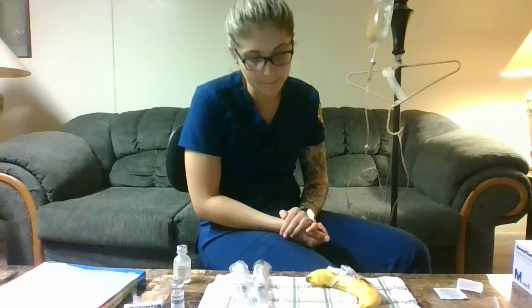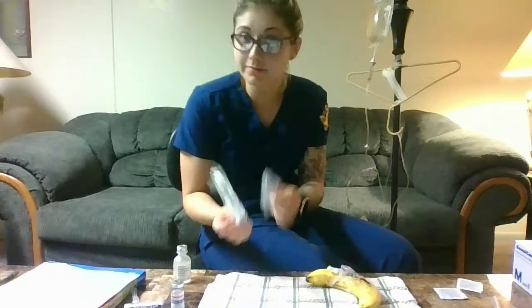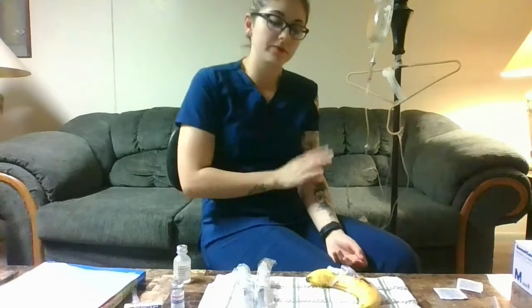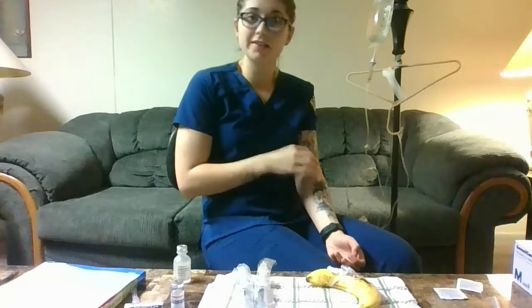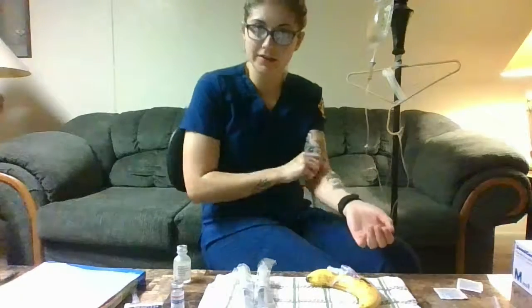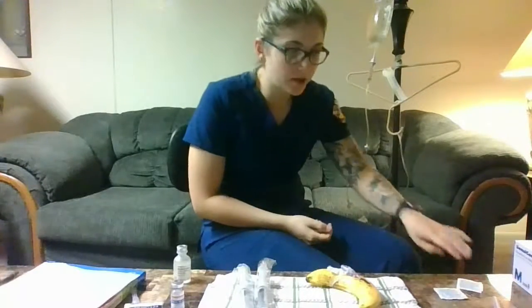So we have an order for the dilaudid. Assess their pain right now, since that's what the dilaudid is for. Before we put anything into the IV, we're going to check the patency of it. Make sure there's no inflammation, redness, they don't have pain at the site. Still intact and they're okay. So that all looks good.